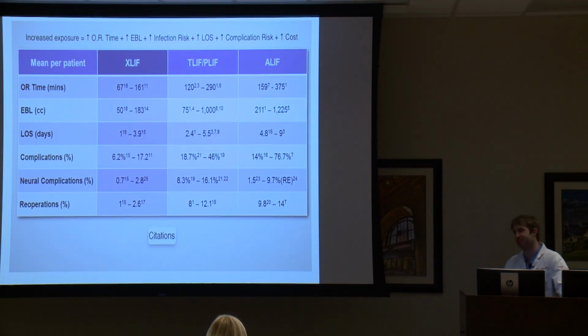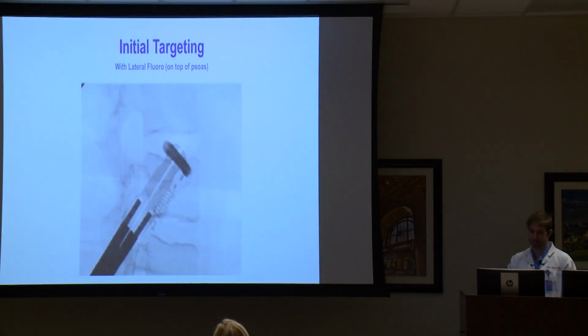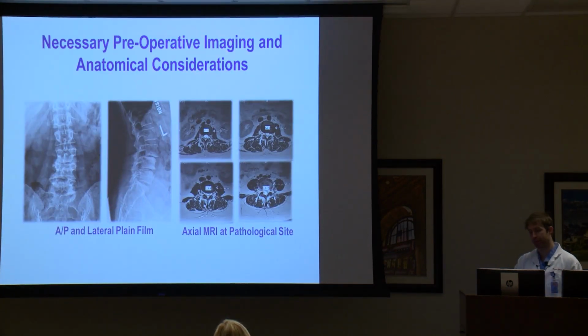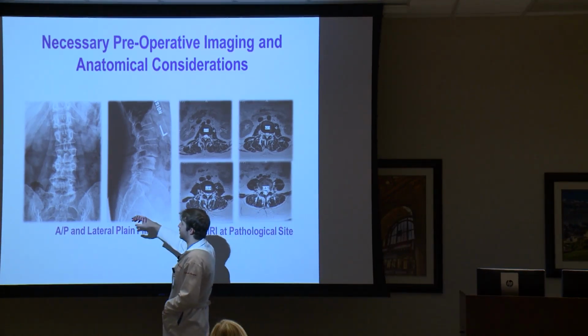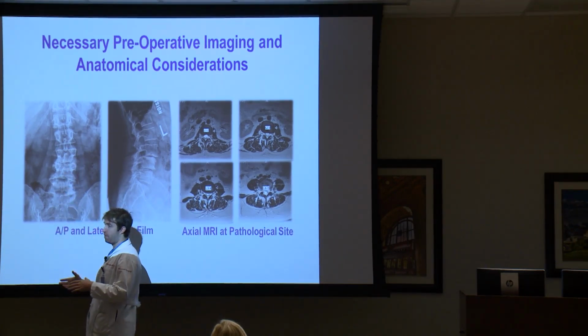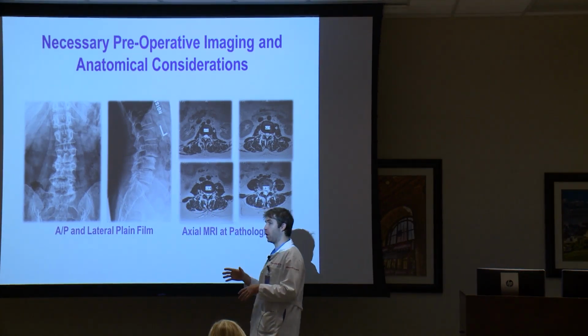Oh, a lot of questions. Do you normally go from one side or the other, or is that patient specific? So it's a little bit patient specific. Perfect example is here, on this patient, I would try to go on the side that's more open. It's not much, but you can make your life a little bit easier, particularly when you've got a little bit more scoliosis than just that. You're trying to go on the open side.